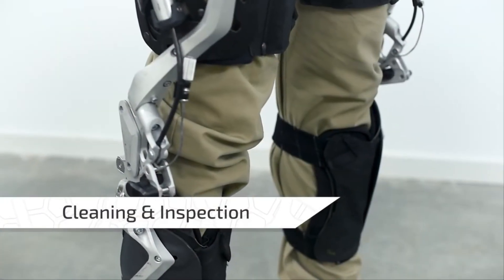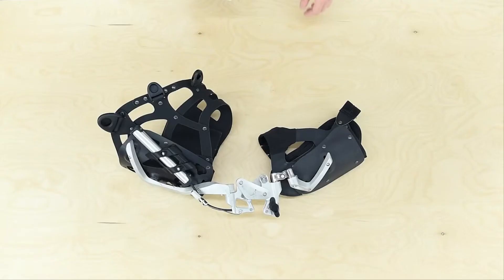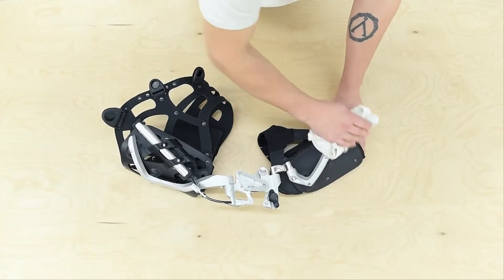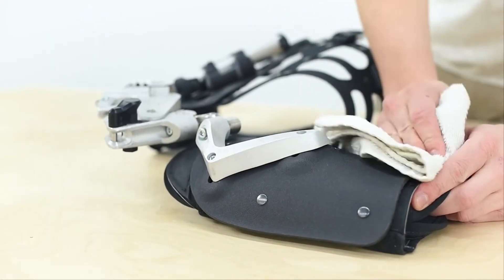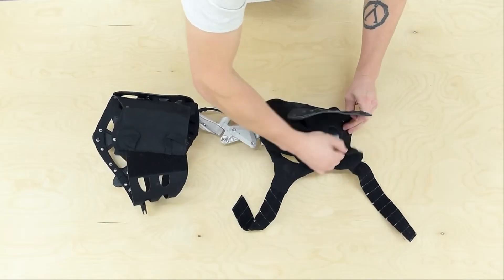Maintaining your exoskeleton and its modules is crucial for longevity and optimal performance. Gently wipe off any surface stains with a damp washcloth. Once undone, the harness pads can be safely machine washed on a delicate setting.